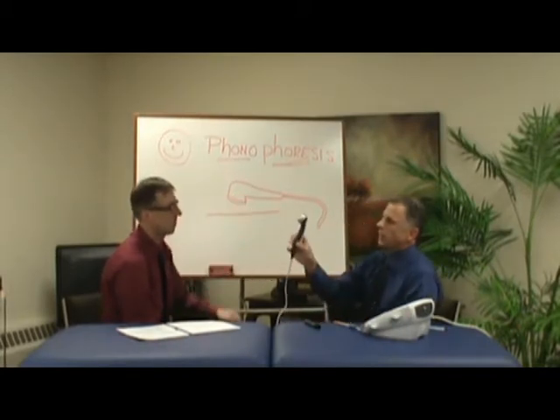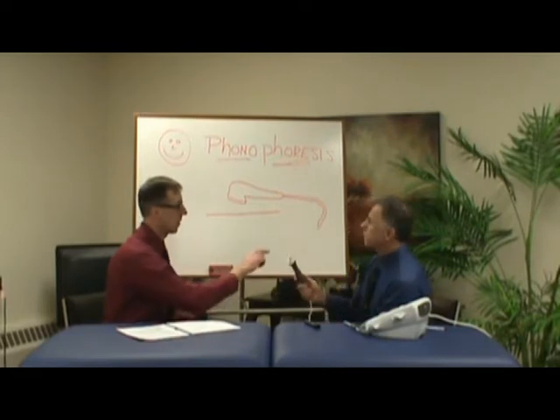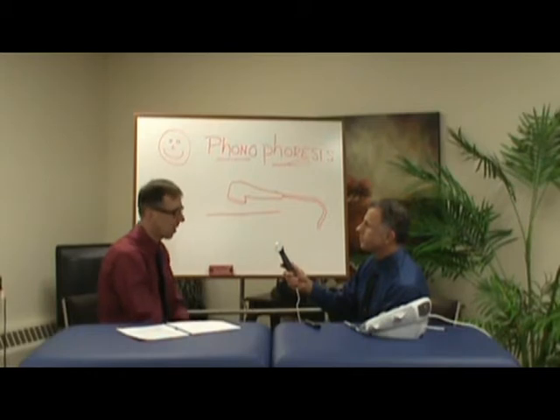Yeah, so this is the actual ultrasound head that we would use. As you see, it connects up to the primary unit that generates the energy for the unit. And there's a little crystal in there that vibrates real rapidly and creates ultrasound waves.